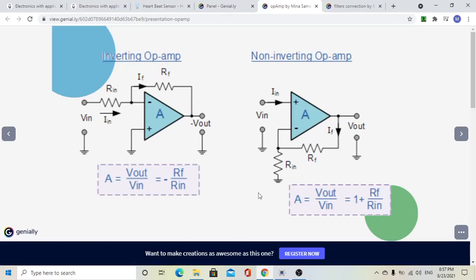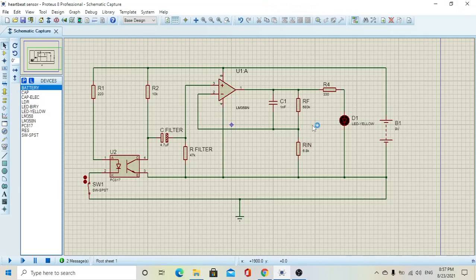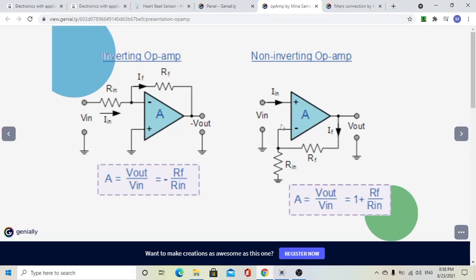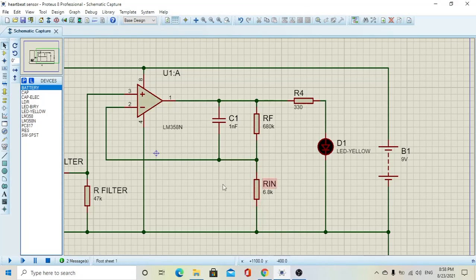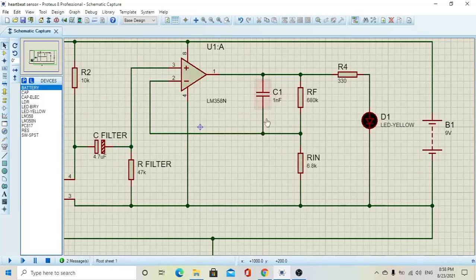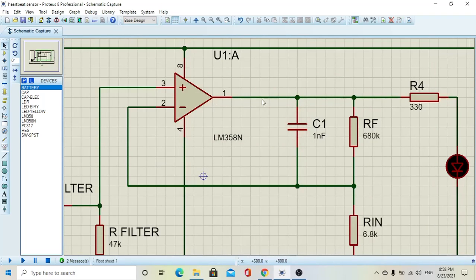We use the non-inverting configuration because we do not want to invert our signal — we want the signal to get high so we can see if the heart is beating or not. We have right here RF and RN. The RF is connected between the negative terminal of the operational amplifier and the output terminal. The RN is connected from the negative terminal of the operational amplifier to the ground, which is connected to the negative terminal of the battery. There is also a capacitor for filtering the signal coming out from the operational amplifier.